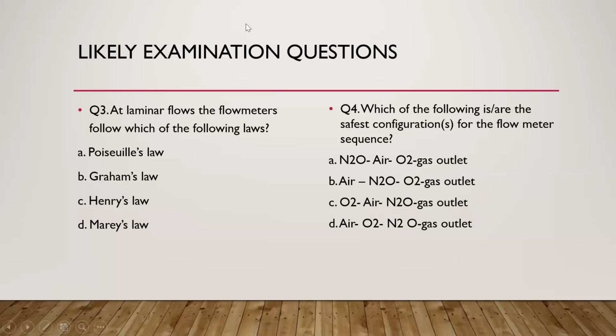Ekwekwe got it, it's B. Oh, okay. All right. The answer is definitely between A and B because oxygen flows downstream and is the last gas to be added. The idea is that if there's a break, we're going to look at that. Don't let me just explain that here. All right.